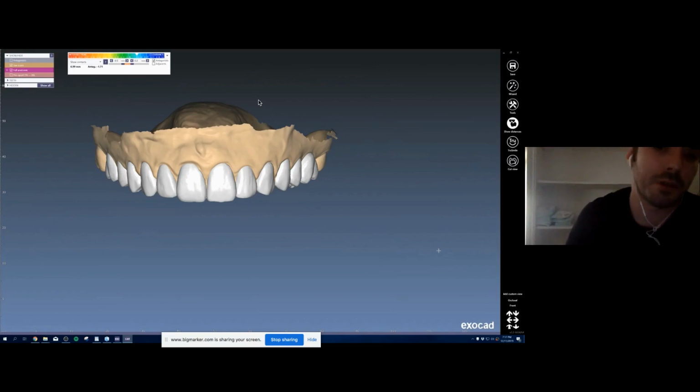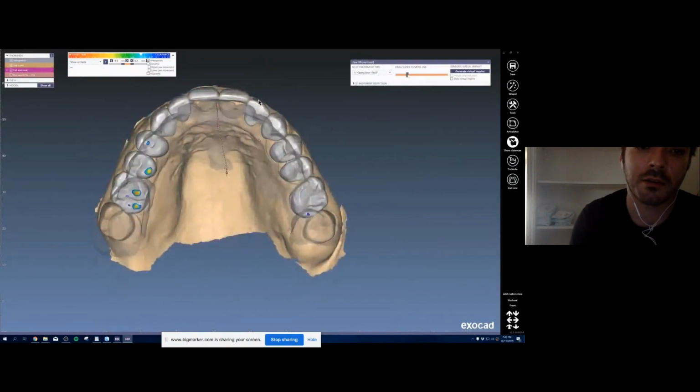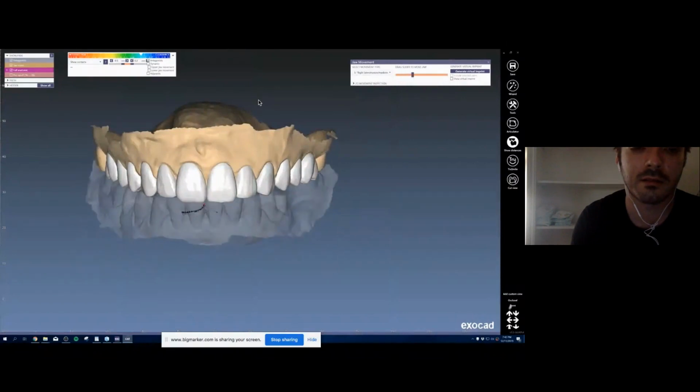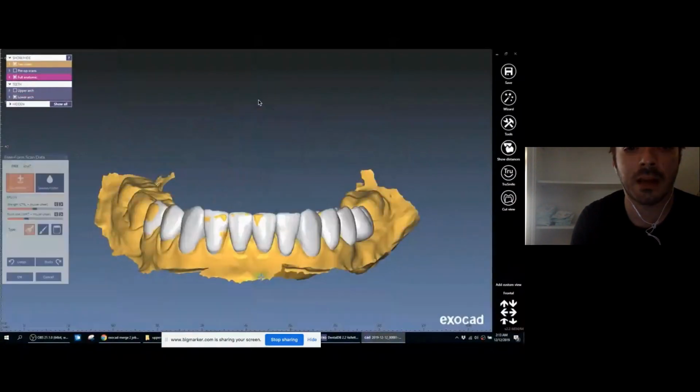You can virtually reduce from both teeth and tissue, and you place your... And then you can see that now we still have the one side, we still have some contacts that are very few. So at this point, we take a library also for the lower.